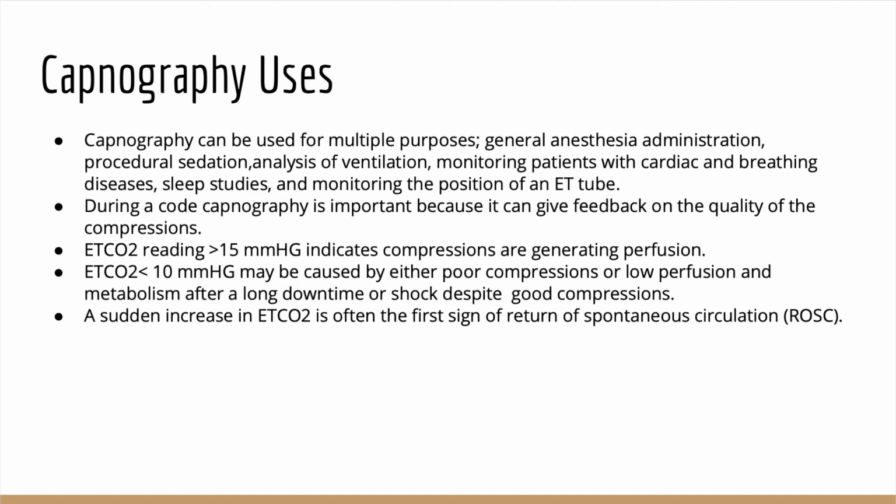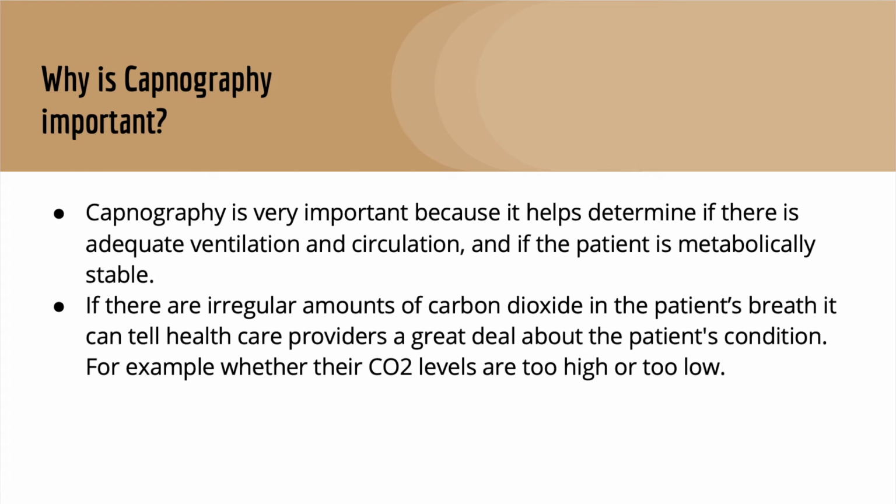It's important to remember, when you're delivering compressions during a code, that if you suspect ROSC and you have them on some type of capnography, you need to be aware, because if circulation is returned, you need to stop the compressions to be able to check the patient's pulses.